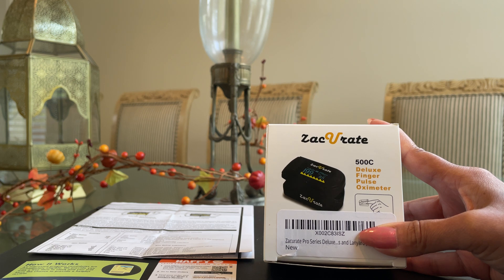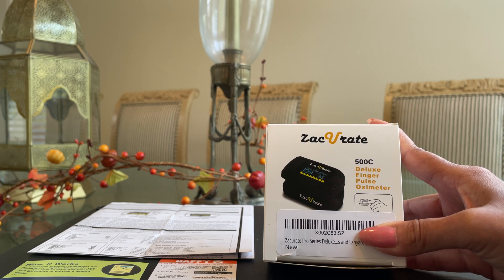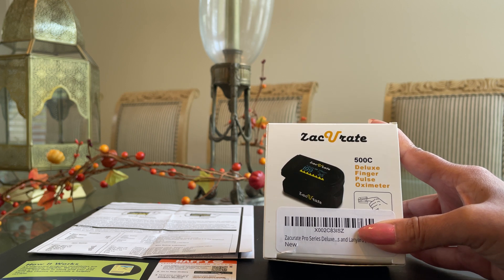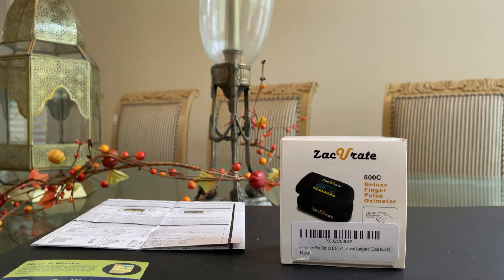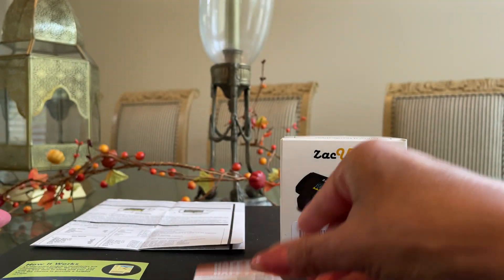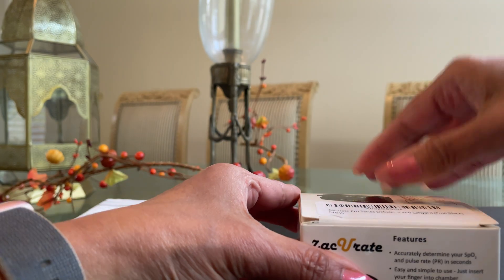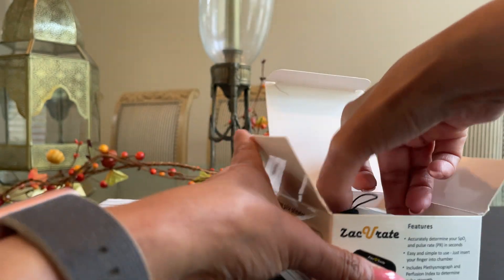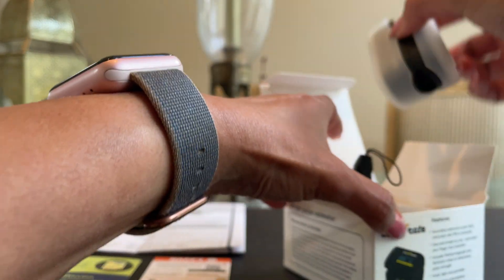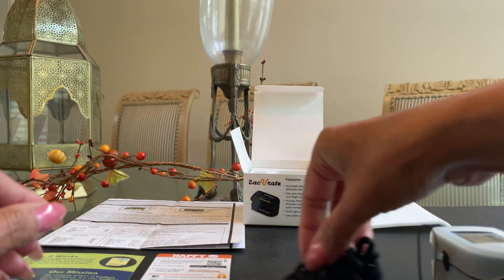Okay, let's now unbox the Zaccurate 500C finger pulse oximeter. On display here are some paperwork that came inside the box that I've taken out. First is the user manual, product review card, and a product feedback card. And inside the box is the pulse oximeter with a silicone case and a lanyard.